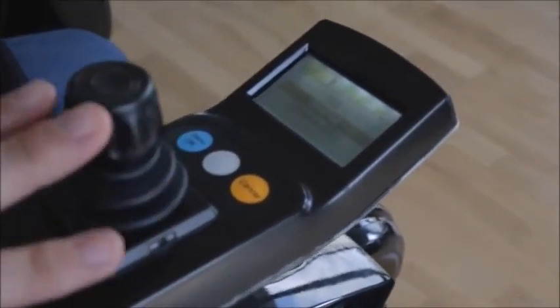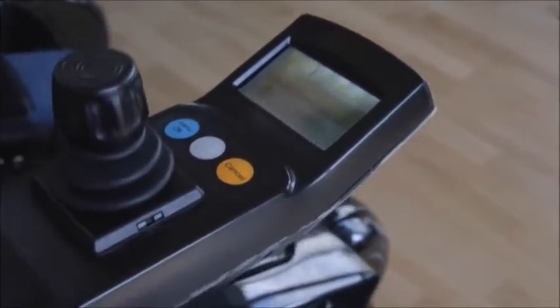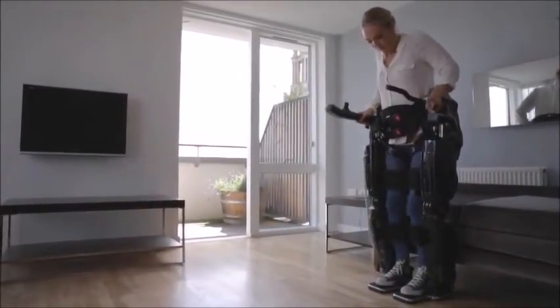Once I'm ready to go, I just turn the joystick and select the stand function. By simply moving the joystick upwards, Rex then stands up. It's important to lean forward as you stand, in the same way that an able-bodied person does when standing up.